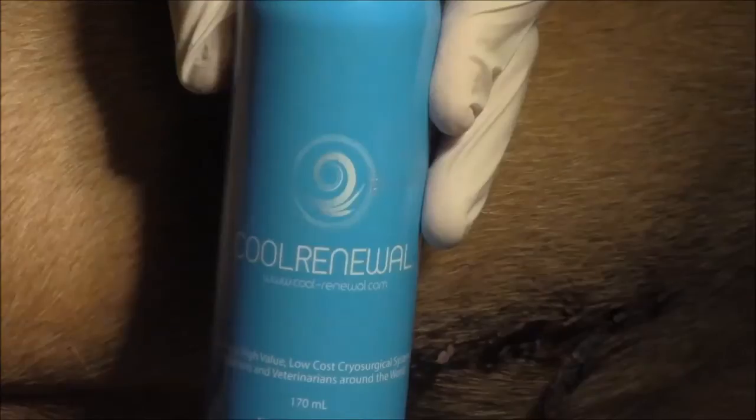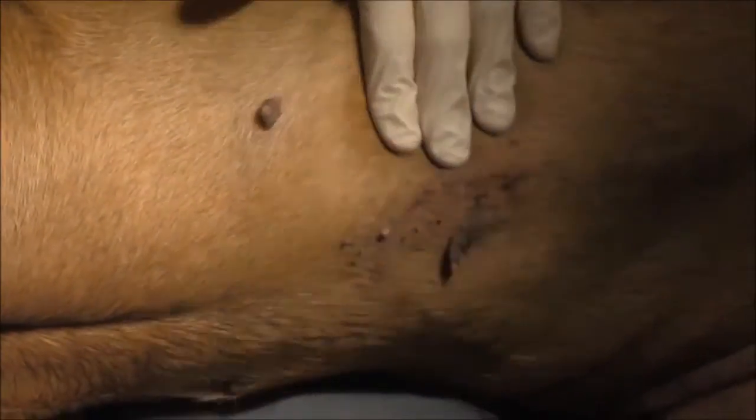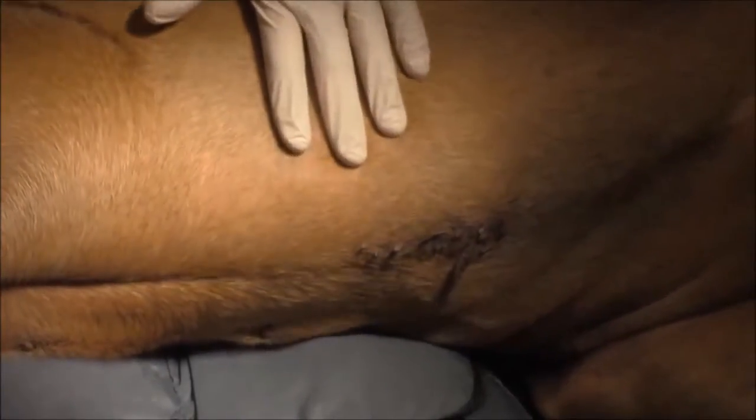You can see it here — it's a cryosurgery product. It's cryosurgery in a can; that's the best way I can describe it. Generally I've done cryosurgery with liquid nitrogen, and this presents a much easier way to get something done really quickly.